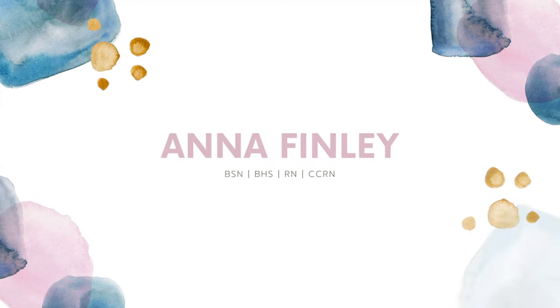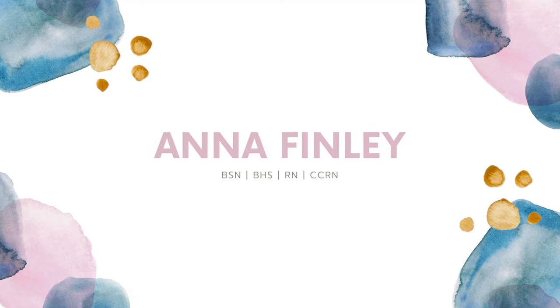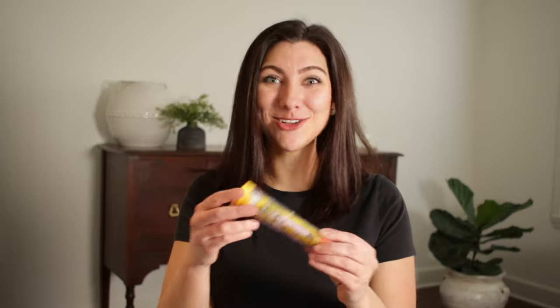It is important for everyone to know how to use an EpiPen, but it is especially important for nurses to know how to use one. In this video, I'm going to show you exactly how EpiPens work — they're really much more straightforward than you think. They look very mystifying coming in these plastic containers, but we are going to go through exactly how an EpiPen works and practice these skills using a trainer EpiPen.